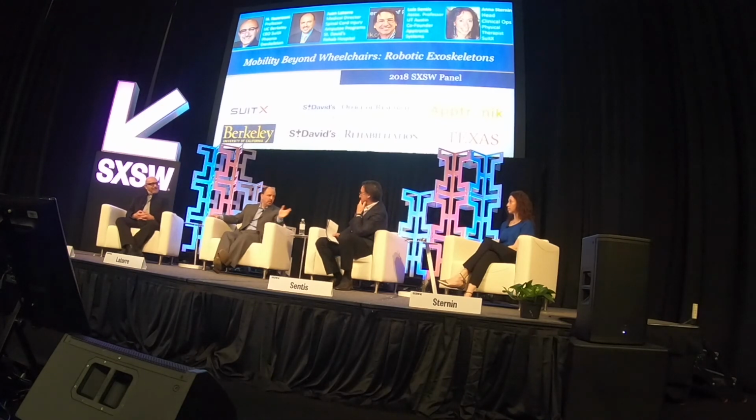Well, I can speak on the functional electrical stimulation. There have been some research studies that have tried to incorporate this technology, putting electrodes in your muscles. Because this device that you see there is not stimulating the muscle in the sense that it's not making it contract. It's just moving it through the normal range of motion of the joints.